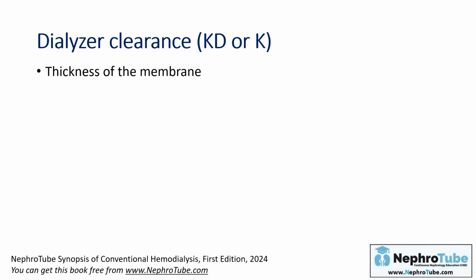Now, what are the factors that can affect dialyzer clearance? First of all is the thickness of the membrane.